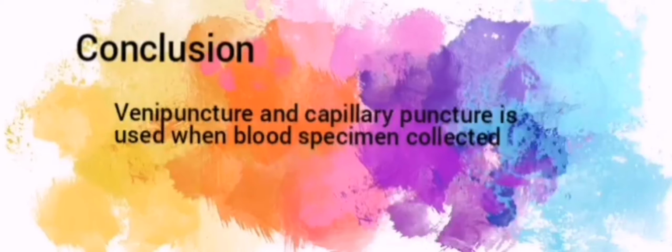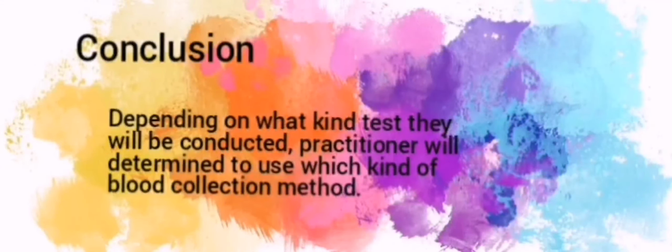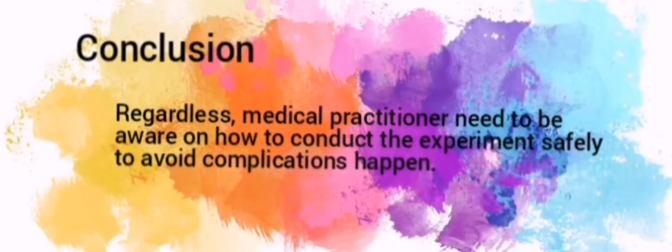In conclusion, venipuncture and capillary puncture are used when a blood specimen is collected. For babies, it is heel stick. This is important for laboratory testing to diagnose disease. Depending on what kind of test will be conducted, the practitioner will determine which blood collection method to use. Regardless, medical practitioners need to be aware of how to conduct the procedure safely to avoid complications.